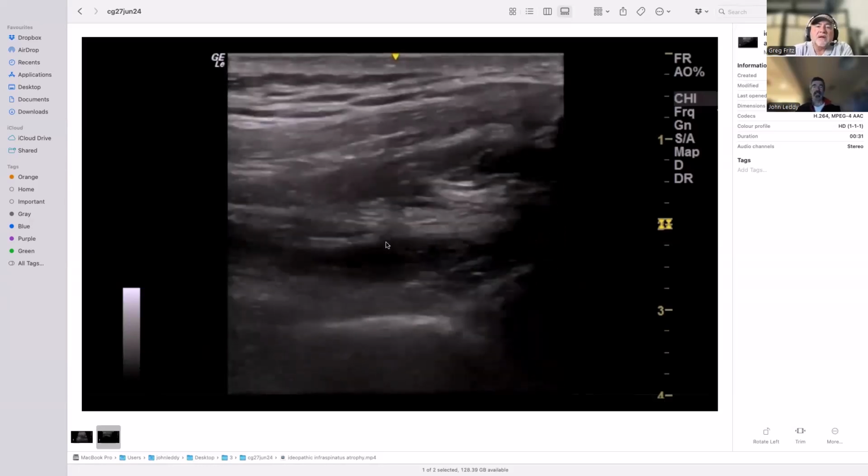And then it colors what you think, particularly if I'm going to be talking to them about whether they need surgery or not. Then if they have severe wasting in the infraspinatus, whether the tendon's intact or torn, then I'm thinking this is chronic. The changes are chronic. The surgeon's less likely to consider a cuff repair.